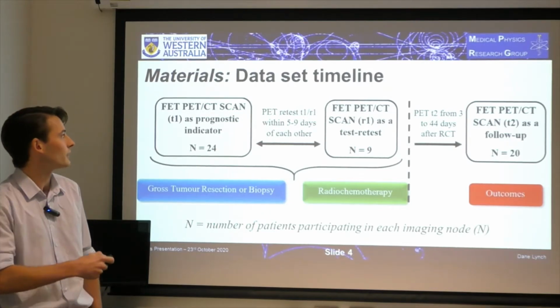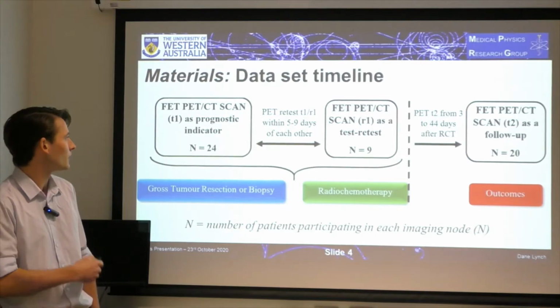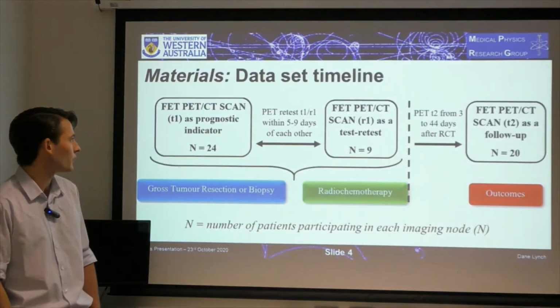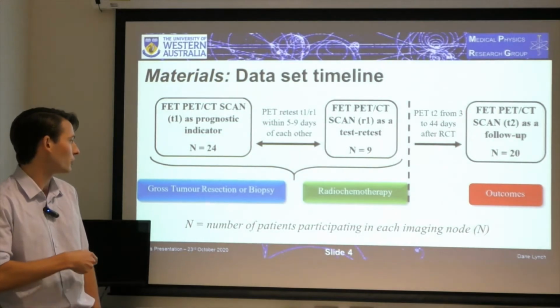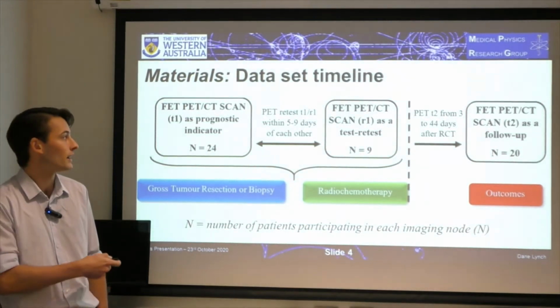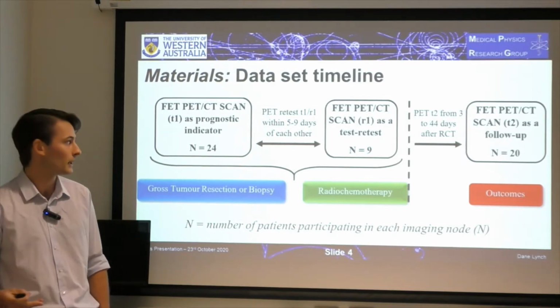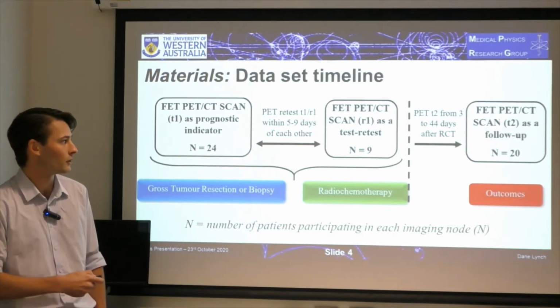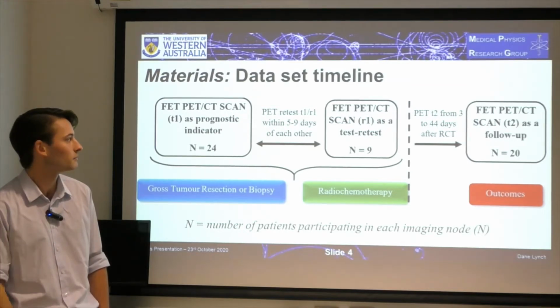This is the layout of the data set that was used for this research. As you can see here, there were 24 patients who had a dynamic and static FET PET scan following their tumour resection surgery. 9 of these patients went on to have a retest scan 5 to 9 days following. And then another 20 of these patients had an outcomes FET PET scan as well.